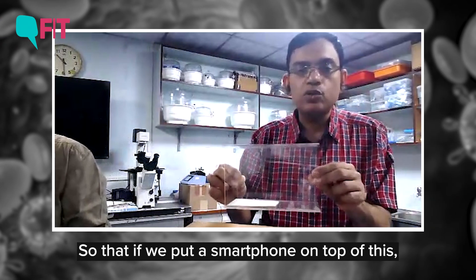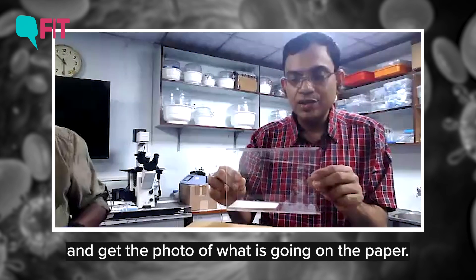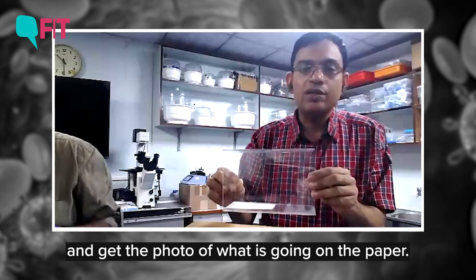So that if you put a smartphone on the top of that, the smartphone camera can look through and get the photo of what is going on in the paper.